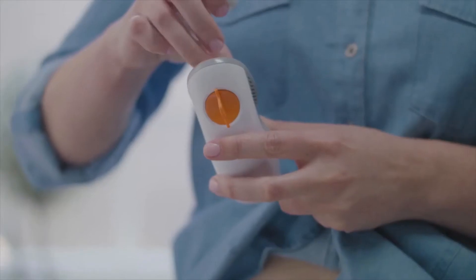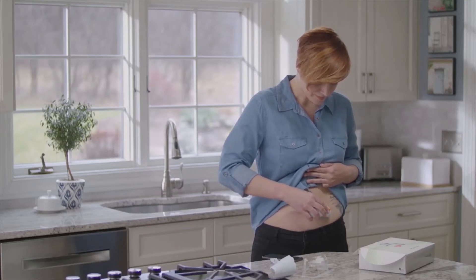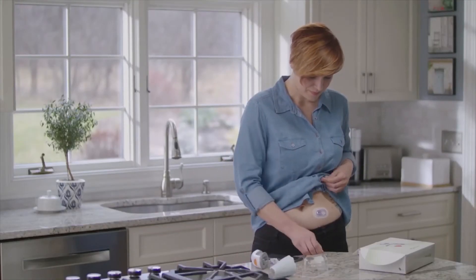Remove both labels. Do not touch the adhesive. Place the applicator on your skin. Fold and break off the safety guard. Press the button to insert the sensor. Remove the applicator.